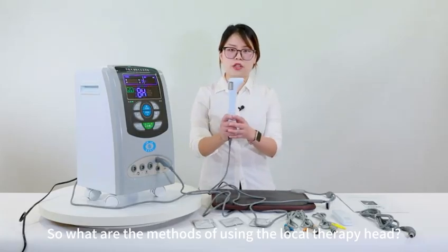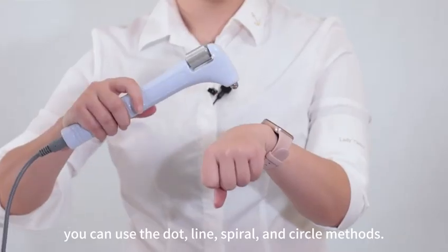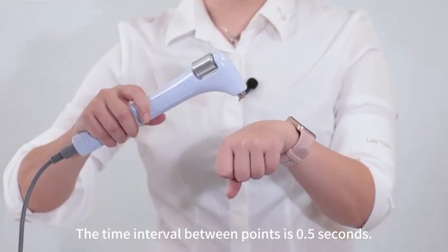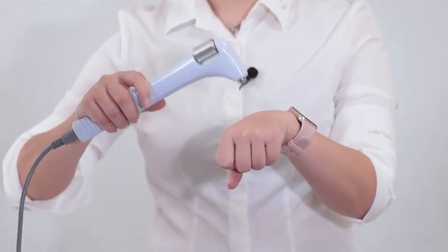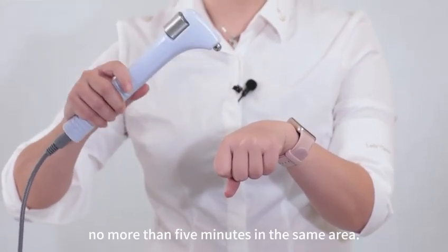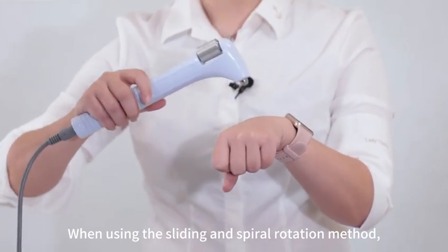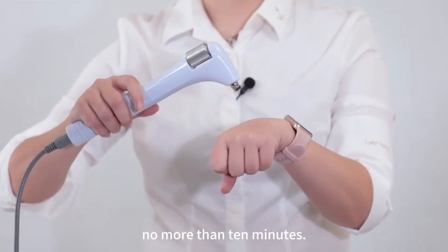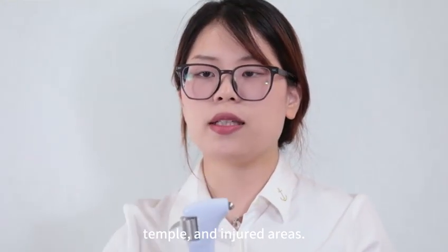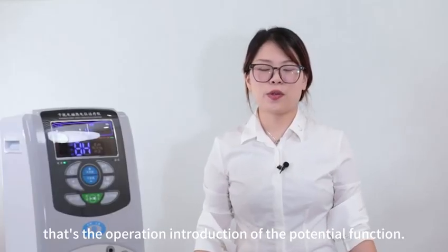So, what are the methods of using the local therapy head? Firstly, you can use the dot, line, spiral, and circle methods. The time interval between points is 0.5 seconds. When using the dot function, no more than 5 minutes in the same area. When using the sliding and spiral rotation method, no more than 10 minutes. When using the local treatment head, you should not use it on the temple and injured areas. That's the operation introduction of the potential function.